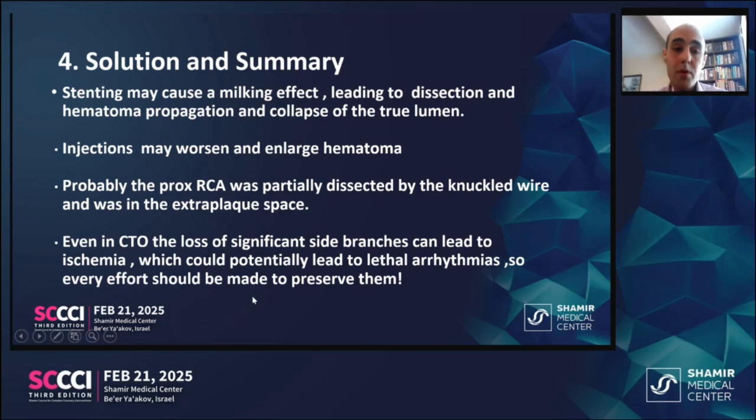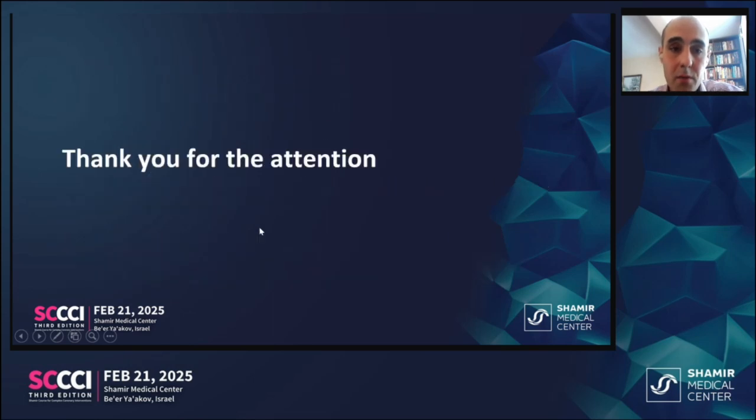And most important, my take-home message is that even in CTO, the loss of significant side branches can lead to a huge amount of ischemia, which could potentially lead to lethal arrhythmias. So during our CTO procedures, we should make every effort to preserve as many branches as we can. Thank you for your attention.